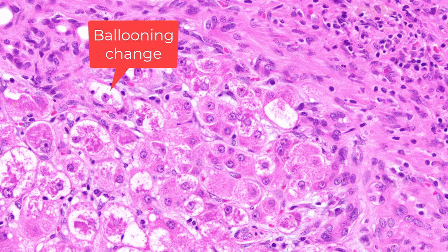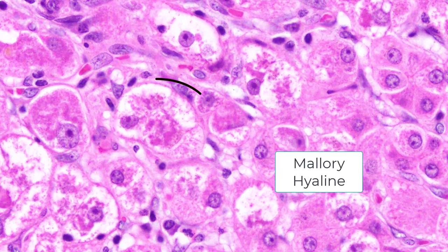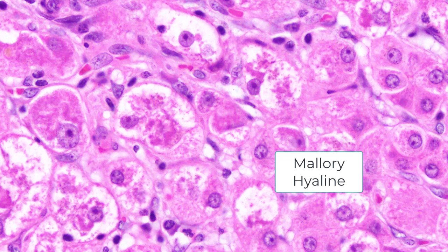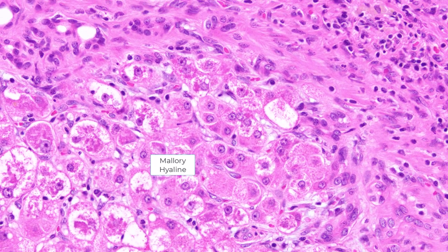Notice these enlarged clear cells — ballooning degeneration — and this thick, ropey, eosinophilic material, which is the Mallory hyaline. So the presence of Mallory hyaline does not always indicate steatohepatitis or alcoholic steatohepatitis.